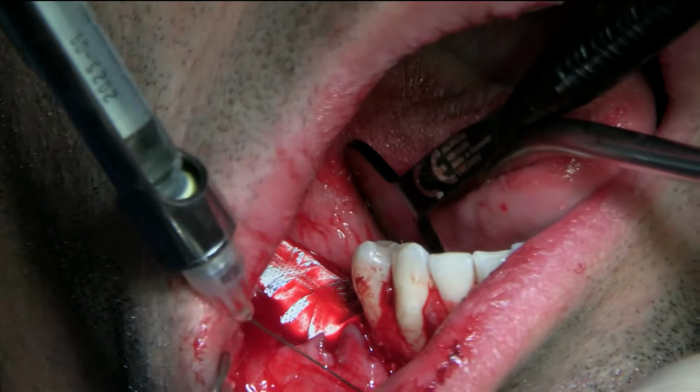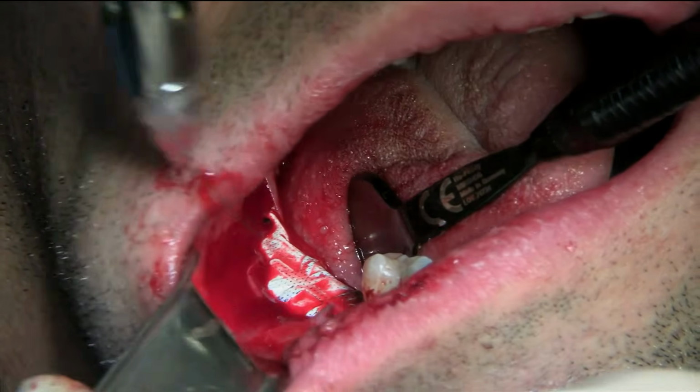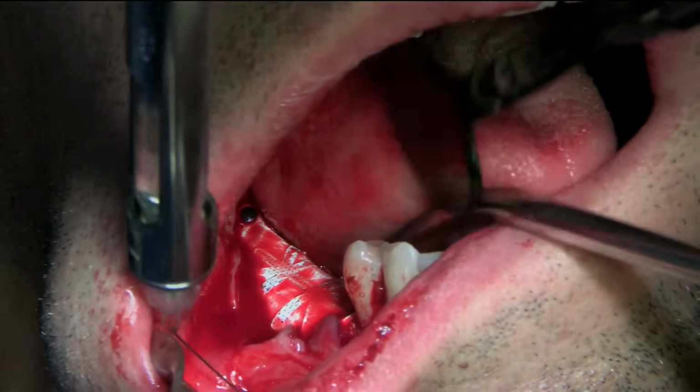Giving you more anesthetic. And you can start giving me like a 3-0 cytoplast suture.